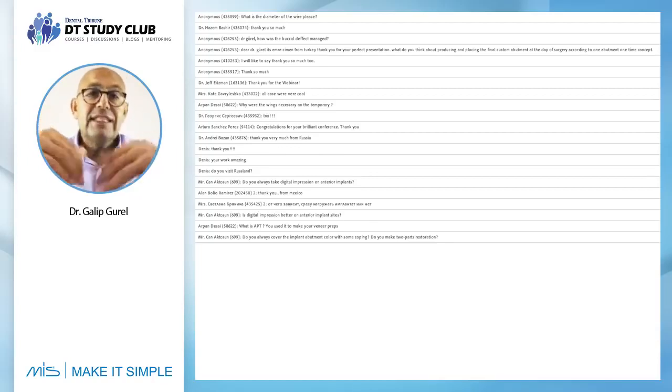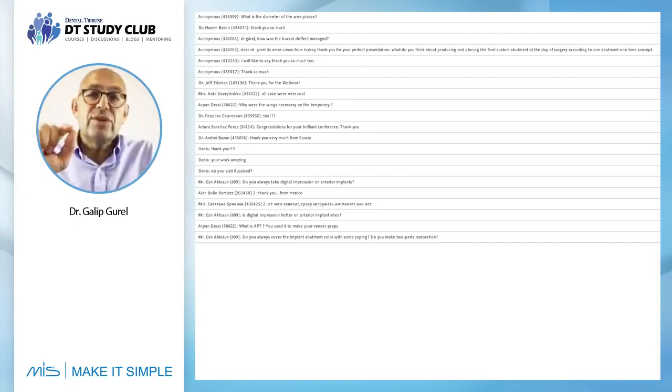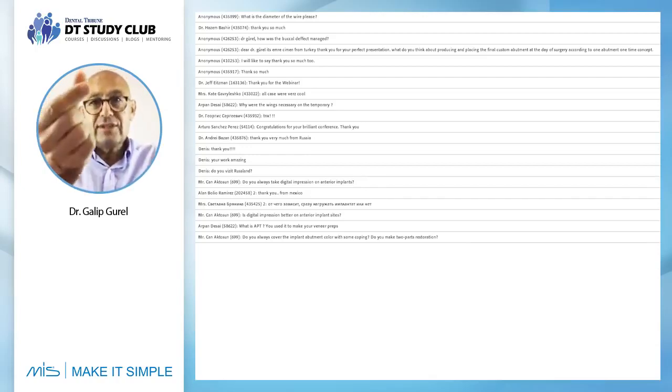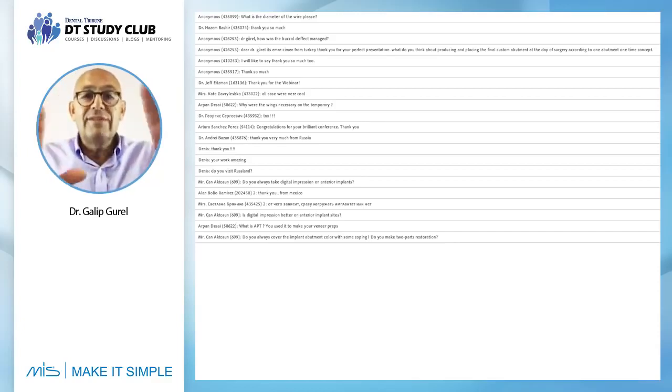And if you didn't have the wings, the only way you can position your crown over the provisional metal abutment is just by guessing it. So it's like either better like this or not. However, if you have the wings, it will be very stable on the adjacent tooth.